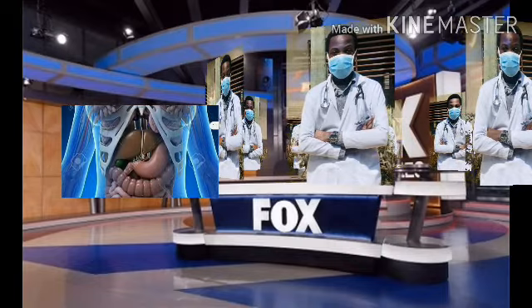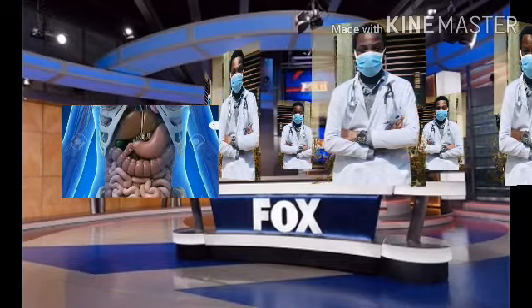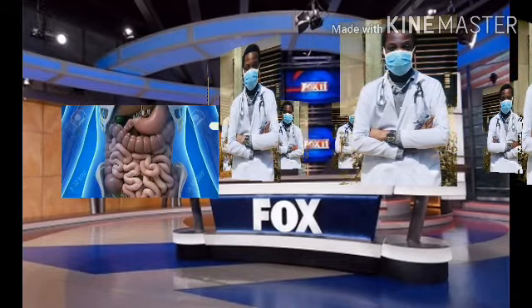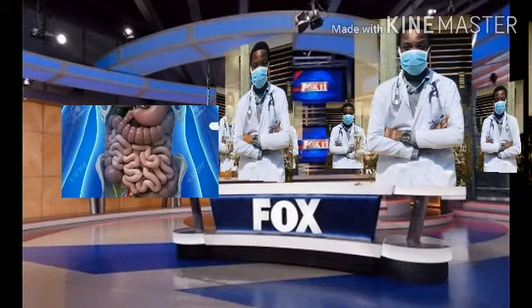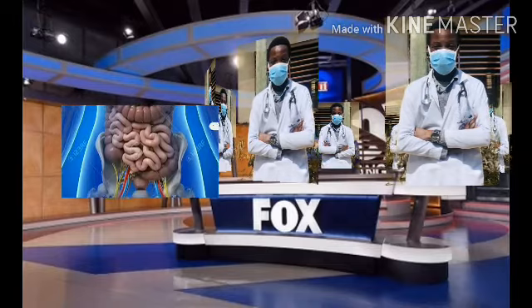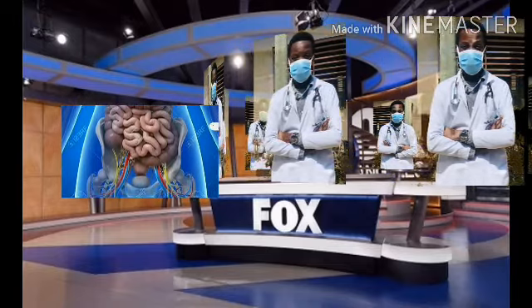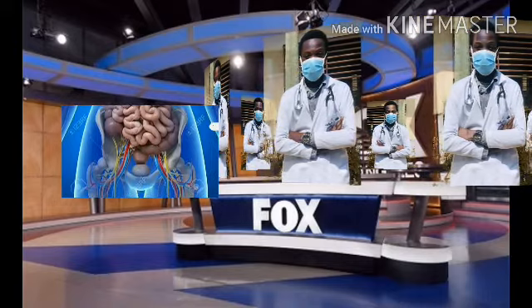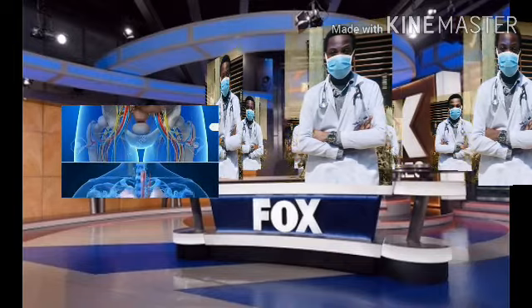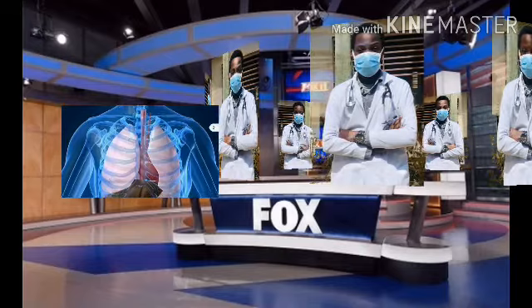So auscultate the chest for breath sounds and avoid using the diaphragm of the stethoscope in a hairy patient. The friction between the hair and the stethoscope will produce crackling sounds, and you may confuse this with adventitious sounds in the chest. Also, in a very thin patient, it may be difficult to get the diaphragm flat on the chest wall. So it's advisable to use the bell of the stethoscope in auscultating the chest for breath sounds.